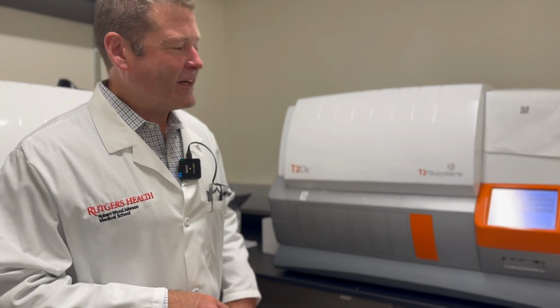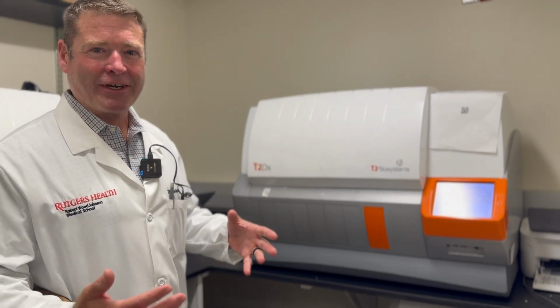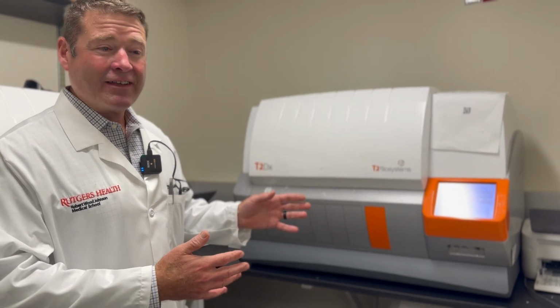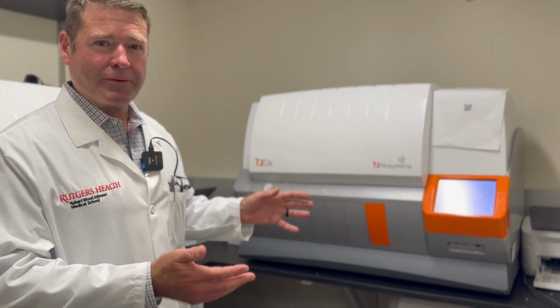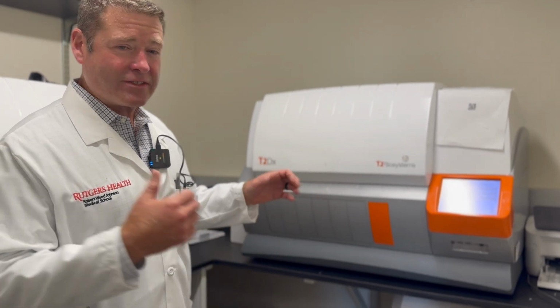I think we all agree that the ideal diagnostic device would be one where you take a specimen from a patient, you put it into the machine, it gives you the answer right away. And that's essentially what these instruments do. So the range of organisms that we can detect is rather limited, but these instruments can detect yeast in the blood in a couple of hours directly from the blood specimen with no pre-incubation required. And so we can very, very rapidly determine whether a patient has fungemia or not using these two instruments.